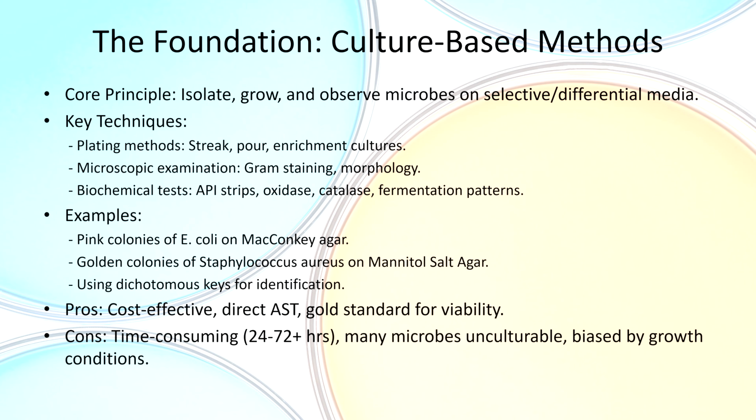These methods are cost-effective and allow direct antibiotic susceptibility testing, which is a major advantage. But they are slow, taking days sometimes, and not all microbes grow in culture, so they have limitations.